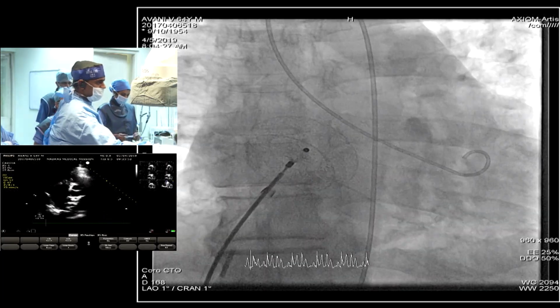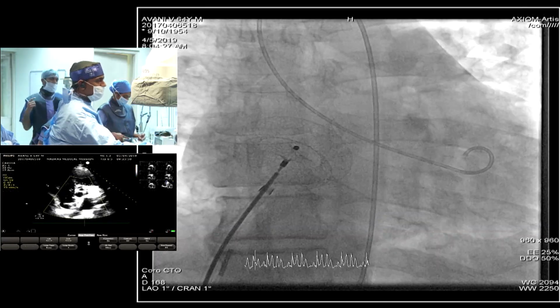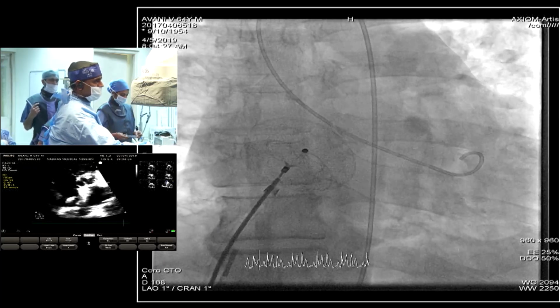This is the parasternal short axis images. You are able to see that small aortic nubbin of tissue is being caught, and this is the cable going through the inferior vena cava, and on the other side you are seeing the.